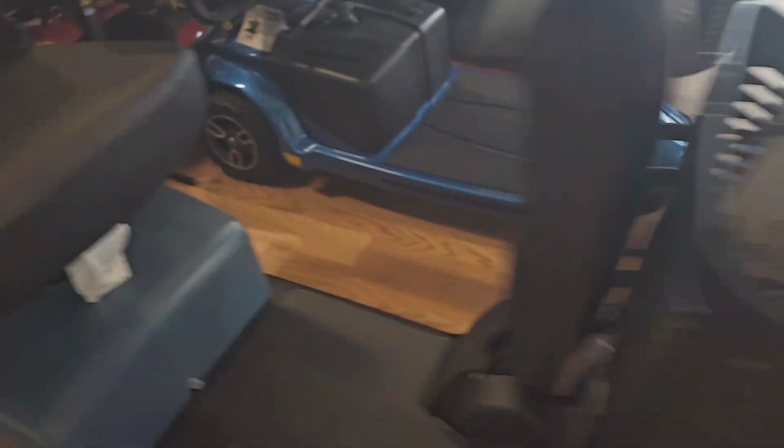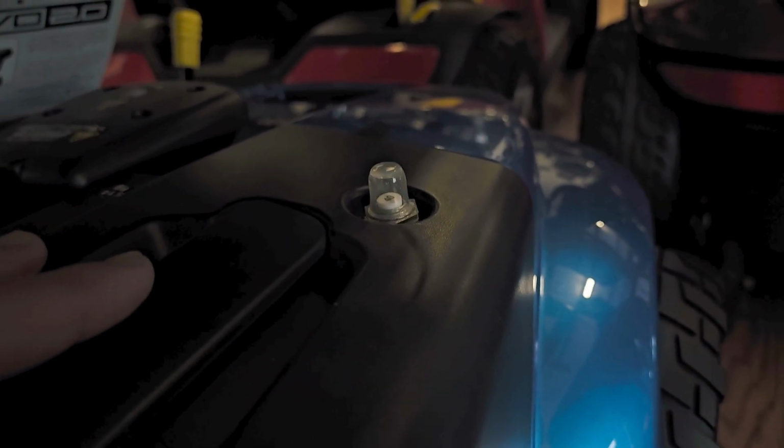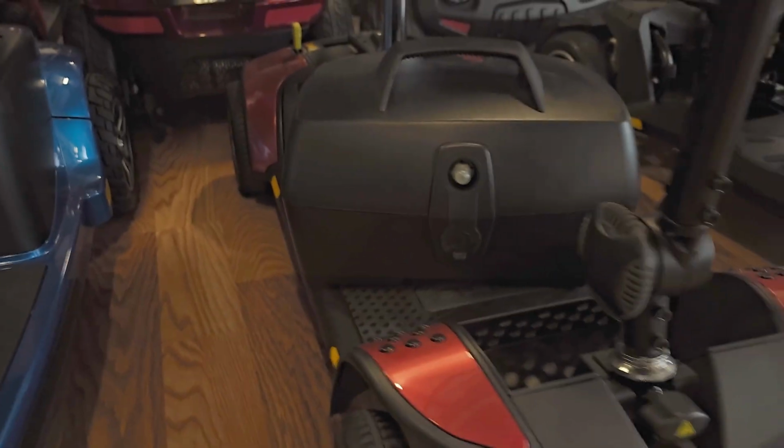So mid-size, you're typically going to see it there. It really depends on the scooter. This is the Pride Revo. These have batteries that come out, a battery pack. Your breaker's actually right there. They typically always look the same, just that clear little bubble right there. Your Pride Go travel scooters, you could see it right there on the front of the battery pack. So you'll want to check around to find the location of this breaker.